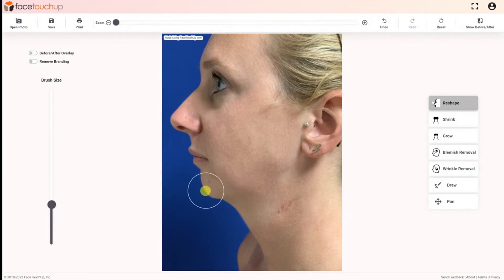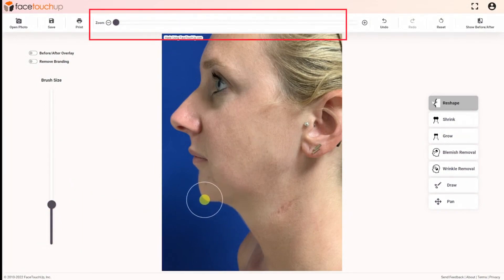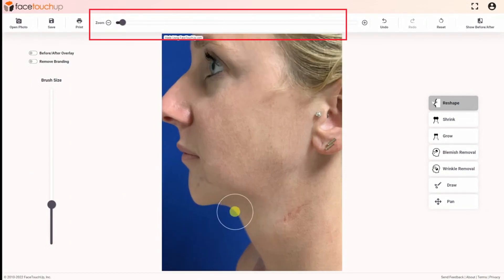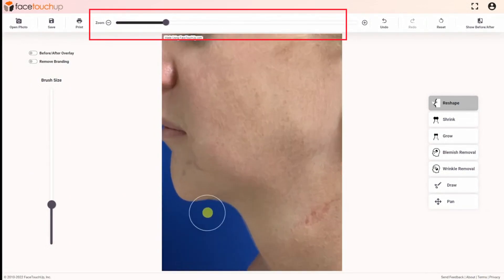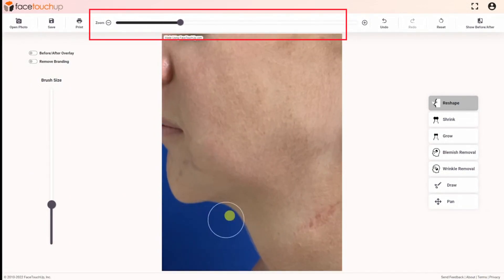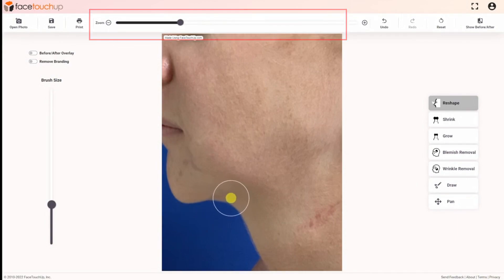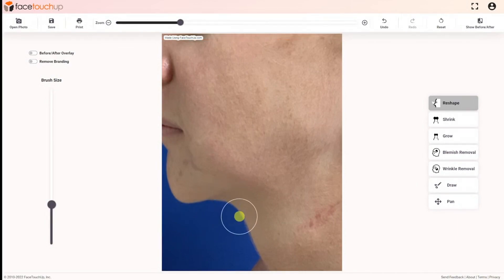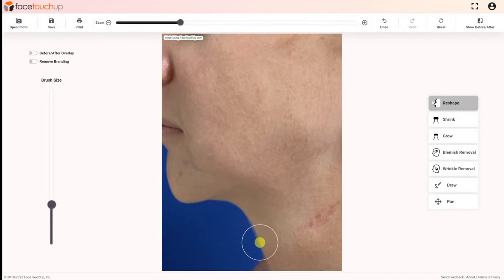For simulating neck lift, zoom into the neck area using the scroll wheel or zoom slider, then click and drag the neck area upwards to remove fat. For chin augmentation, click and drag the chin area forwards to simulate implants.